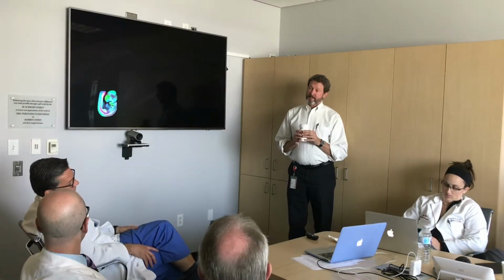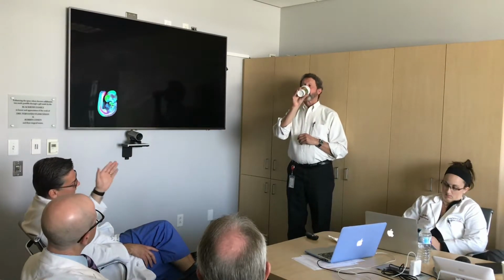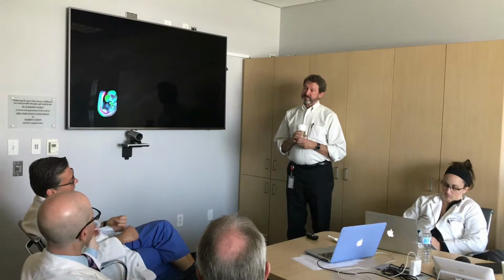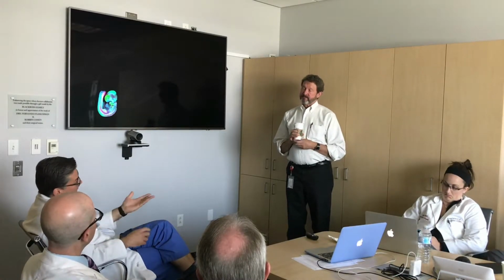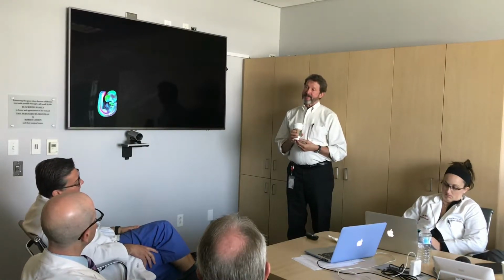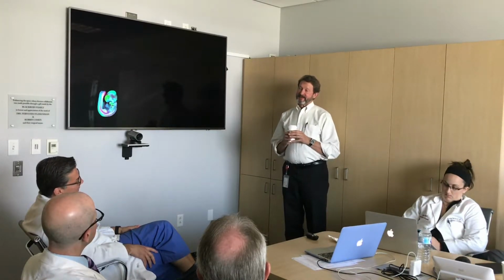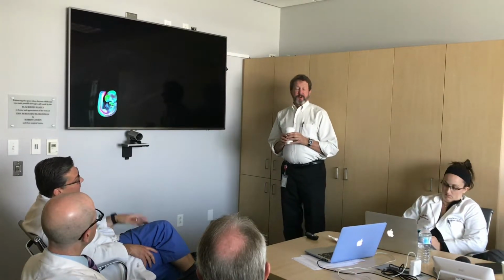So for years in coronary arteries, we've been chasing the concept of the vulnerable plaque. I mean, thermal maps fail. We use intravascular ultrasound. Now we have intravascular OCT. And that improved the resolution, but still, we don't have a good answer yet. So we have virtual histology.